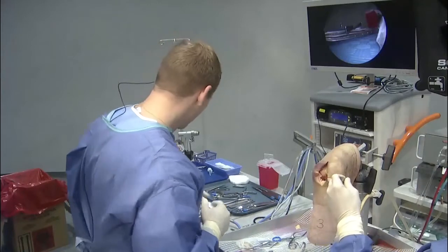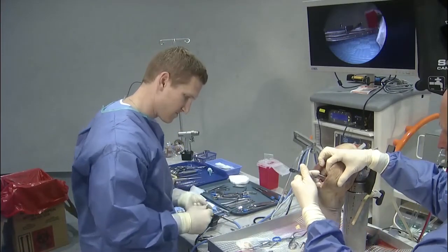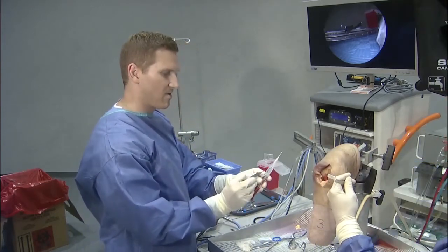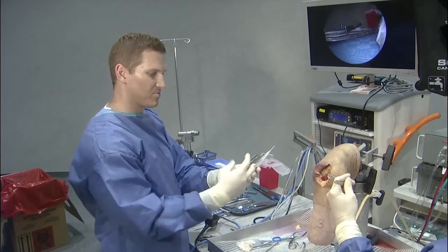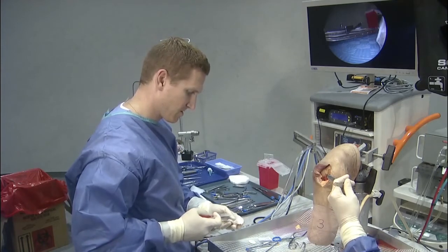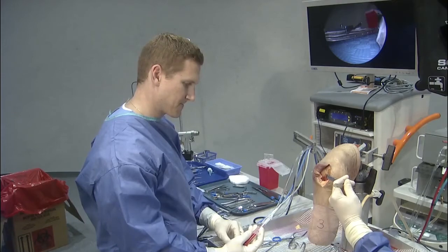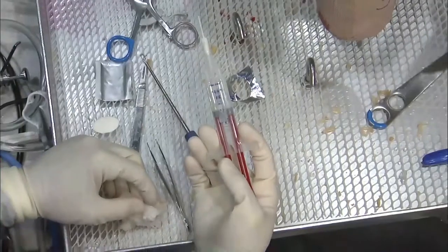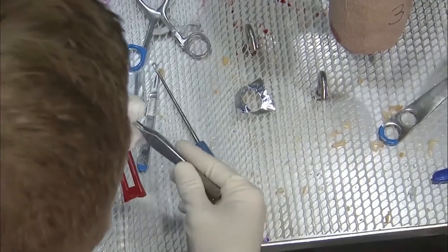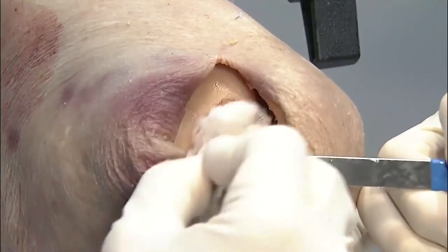So the biggest difference between manufacturers for that, correct me if I'm wrong, is that one is already mixed, or does it mix also as you inject? This is a dual chamber here. I don't know if you can see, but it mixes as you push it forward. Right, and I guess I should have been more clear, the actual catheter is not split. Is that correct? That's correct. There are some that are split at the catheter so that it doesn't mix until it actually gets out of the entire device.